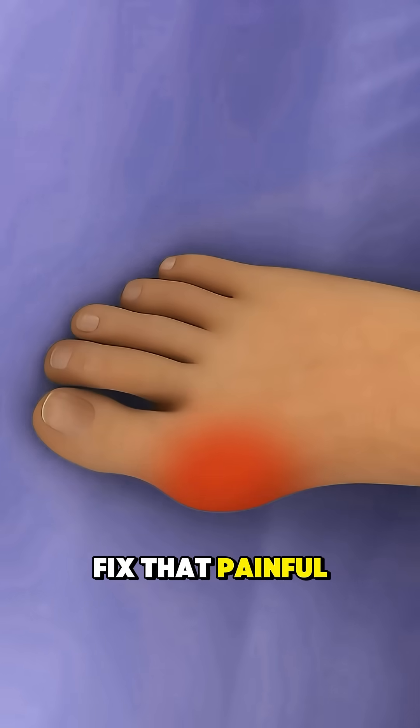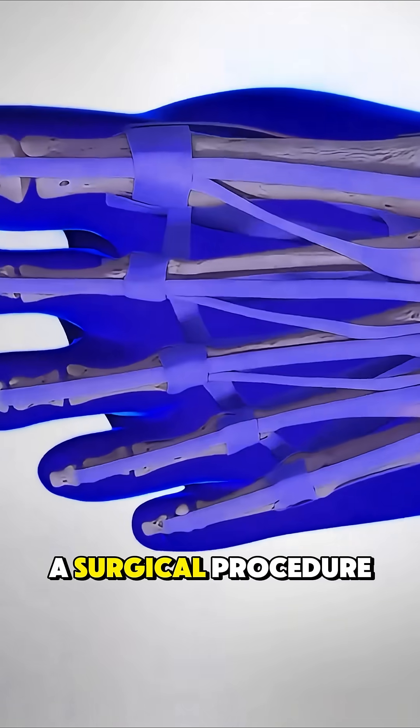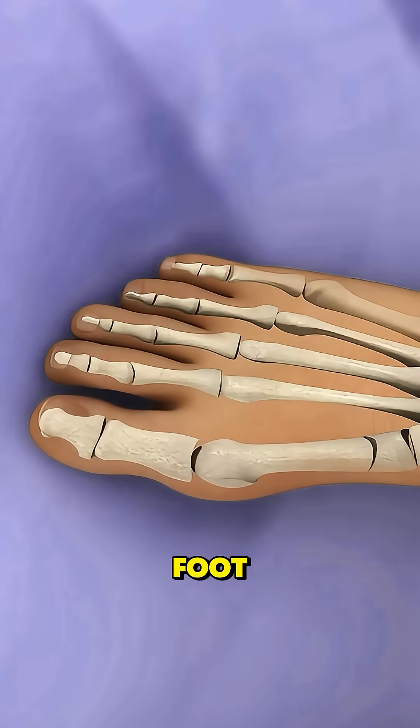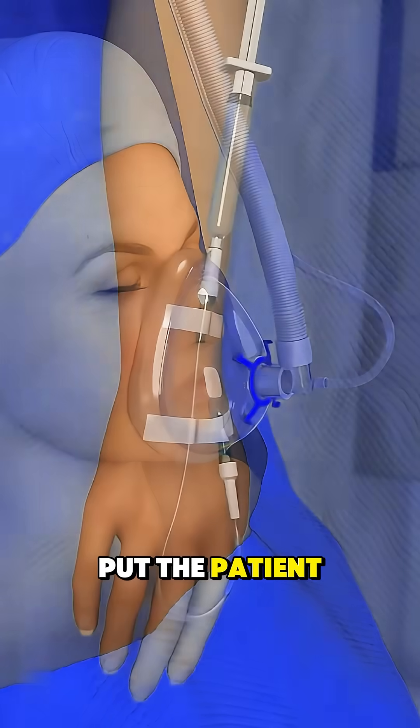Ever wondered how surgeons fix that painful bump on the side of the big toe? A bunionectomy is a surgical procedure used to remove a bunion and realign the bones in the foot. It starts with anesthesia to either numb the foot or put the patient to sleep.